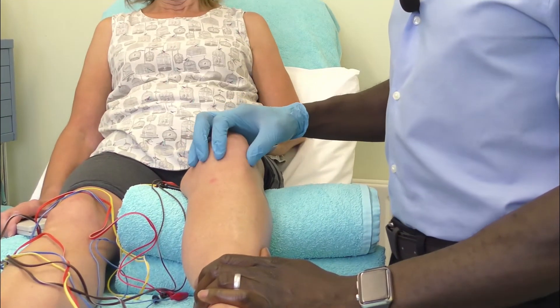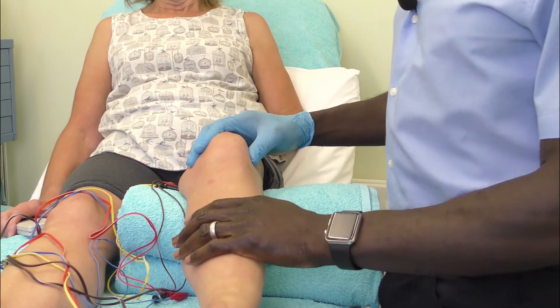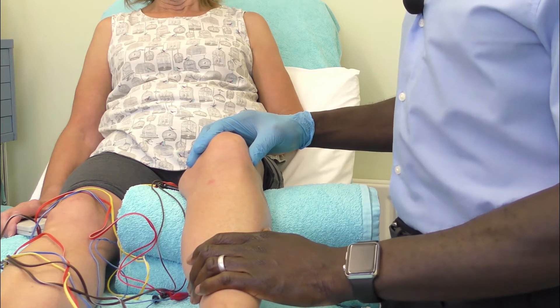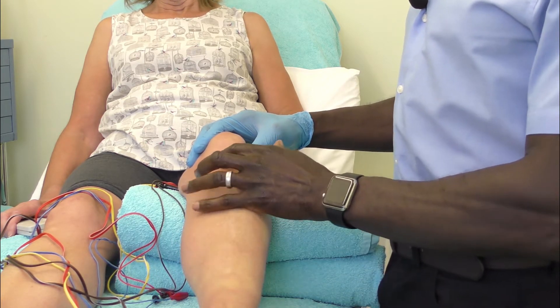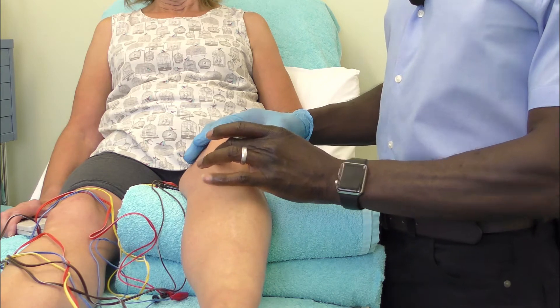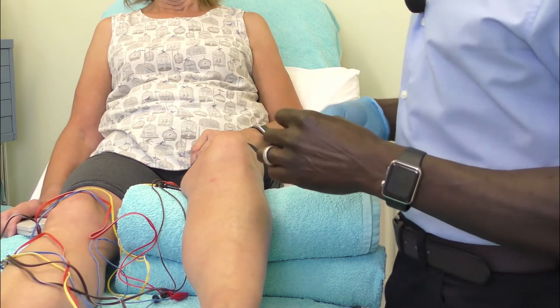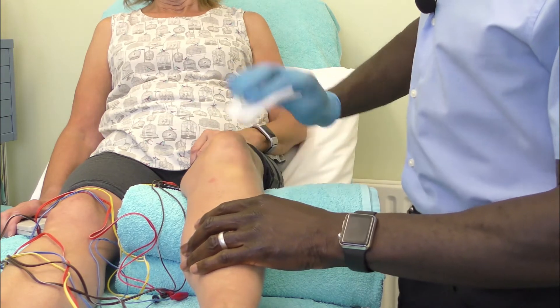So let's take a quick look at how we can go about applying the electroacupuncture. When you're treating osteoarthritic knees there are a number of points that can be used. Your main points are going to be what's called the eyes of the knee — these are the first two and most important points that you're going to start to apply.